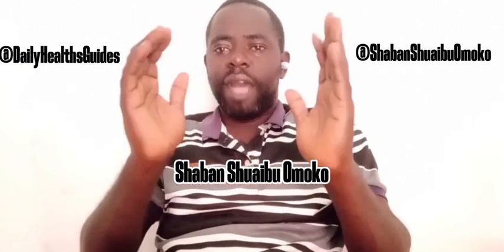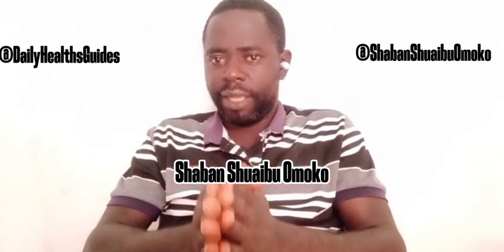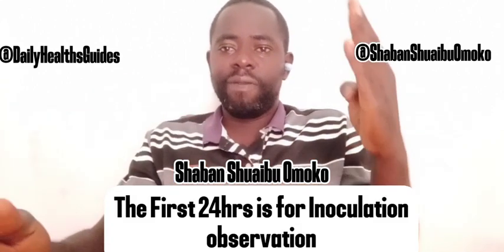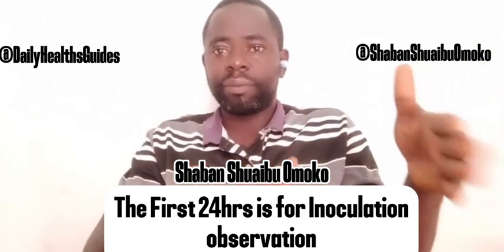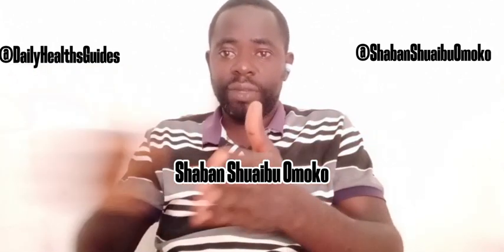Now, after that, the culture takes 3 days before the result will come out. Some take more than 3 days, depending on the investigation, but most investigations take 3 days. The first 24 hours is to inoculate the media, which they will be observing for the next 24 hours.